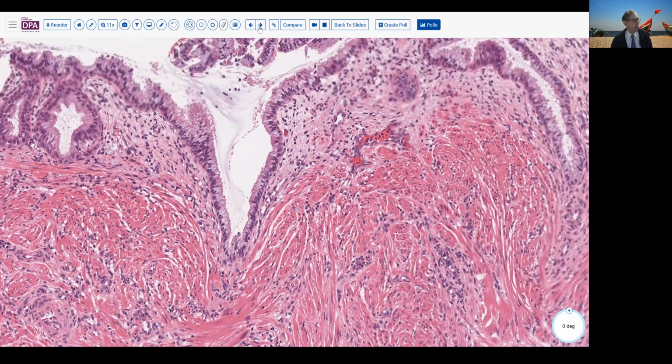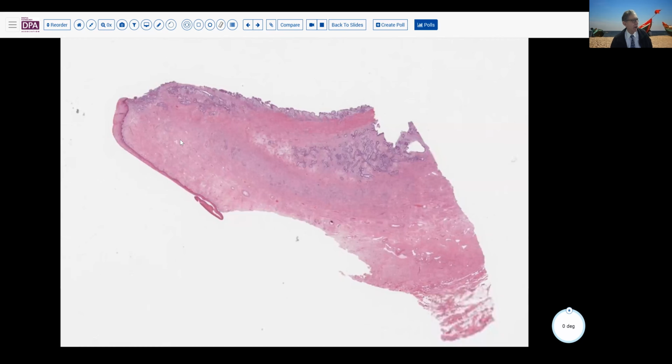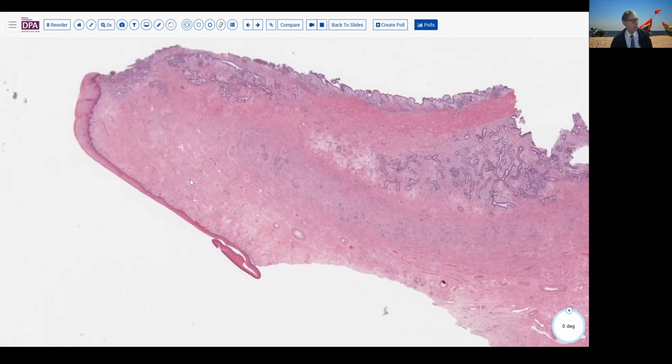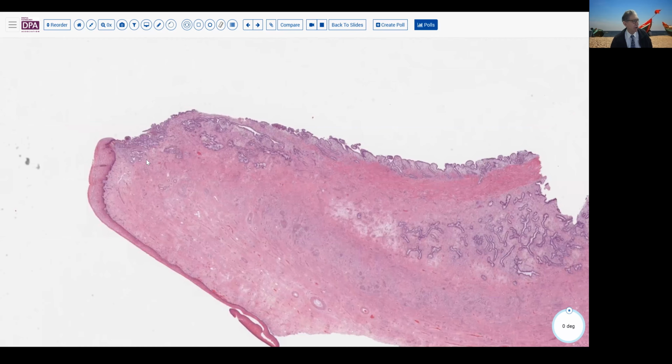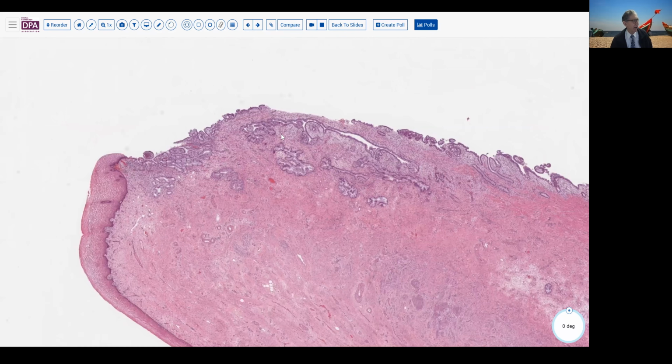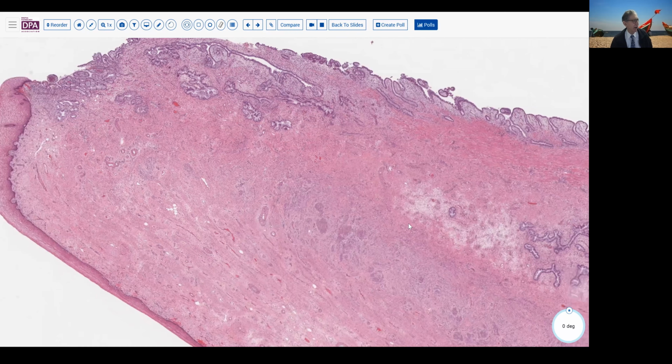That would have been an interesting isolated finding, but the other sections from the cervix had an even more pronounced change. Here again, we see a sharp squamo-columnar junction located as expected, and normal endocervical stroma and glands. A few scattered bundles like this, as we observed previously.